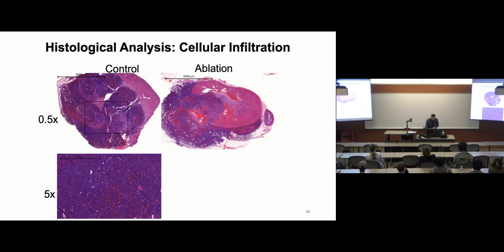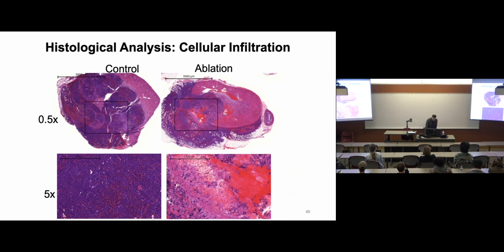For the treated region, I like this image because you can actually still see the kidney and the relative size of the tumor compared to that. If you zoom in close to the ablation zone, you see things you expect. Because of the processing of these samples, you see these white regions which are consistent with liquefaction. It's basically the liquefied portions of the tumor that have been drawn out during the histology processing. So we're able to cause ablation, which I think is no surprise.